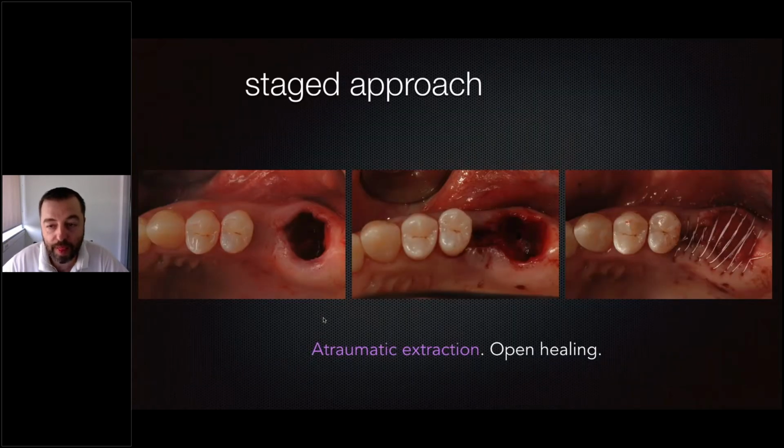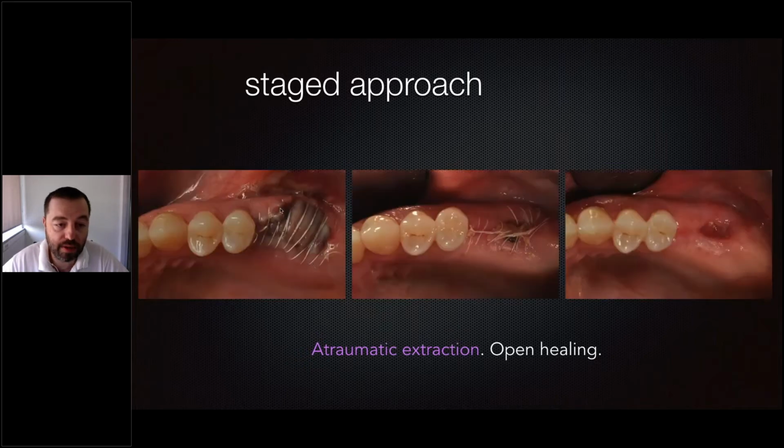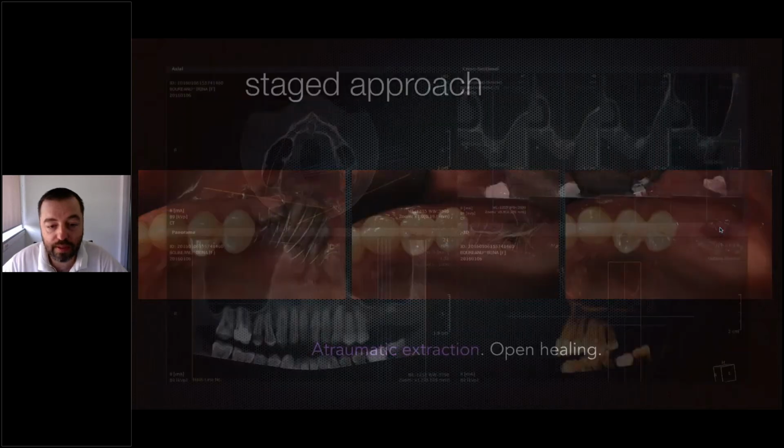Now, for that, as we had no buccal bone, we needed the BIOS and BioGuide and the open healing. You see, basically, there is no tension, there is no flap, and here is the membrane suture with a continuous PTFE suture. And the healing period, after 3 weeks, we take out the suture. And this is the outcome after the healing.